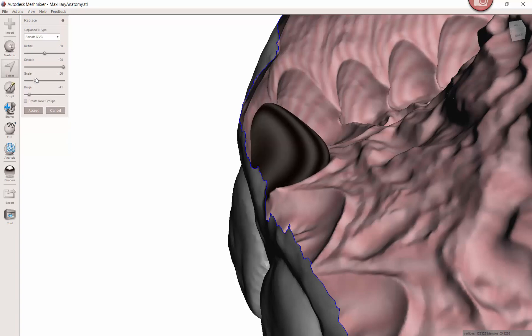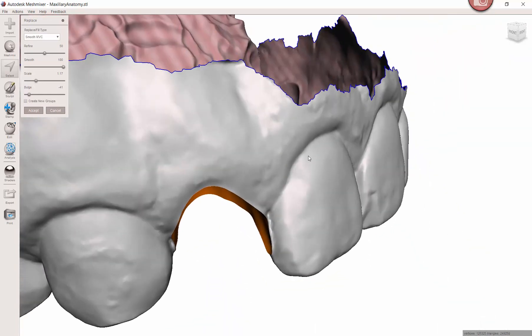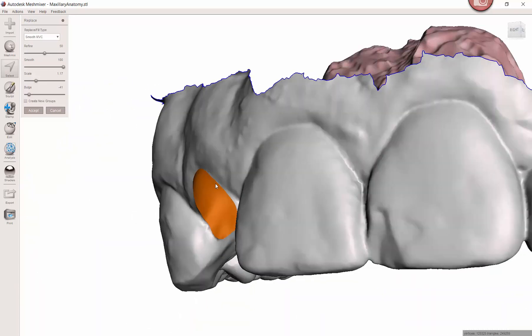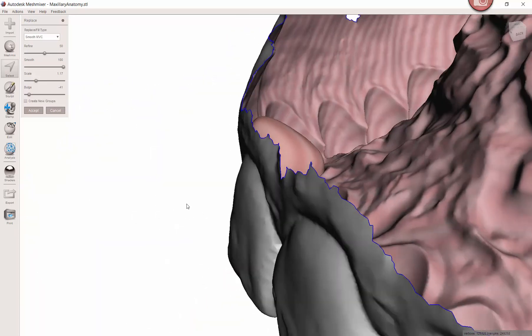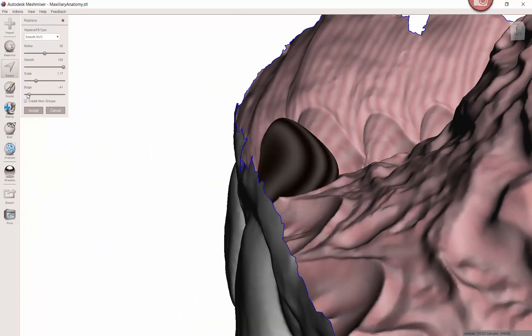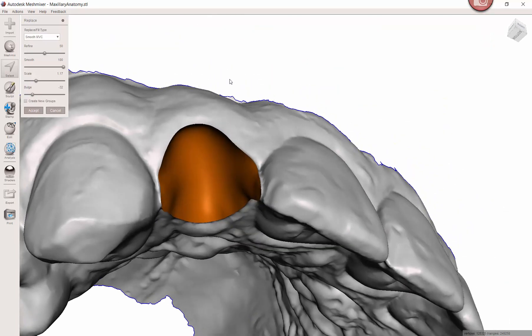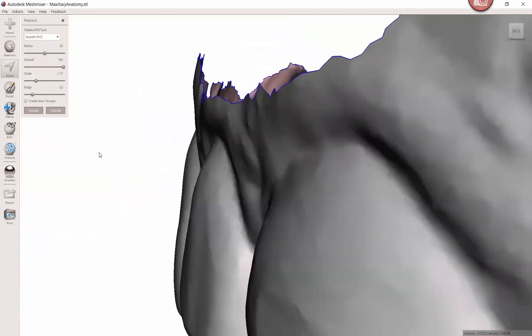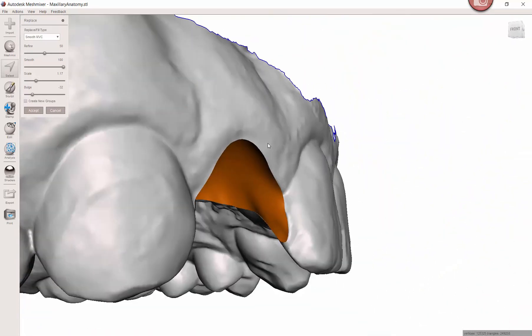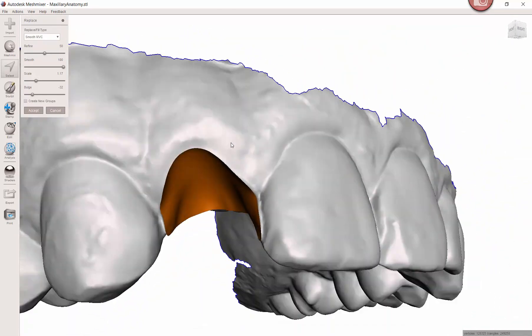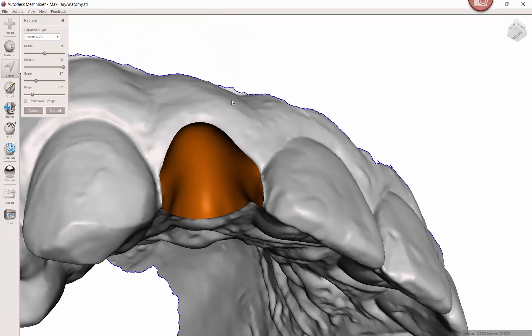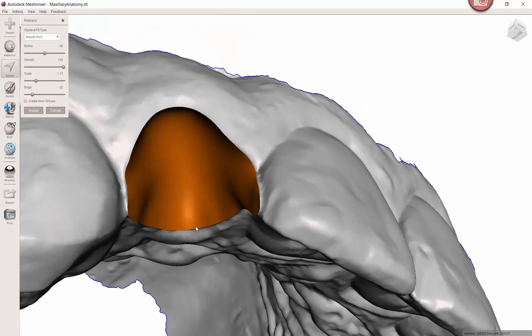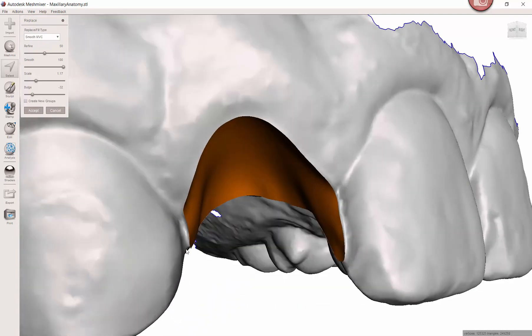If you're going to be creating some sort of flipper or Maryland bridge or whatever, an immediate temporary, you might want it to be a little more ovate so it extends down in there. So pick your poison, choose your adventure if you will. When I'm done I hit accept and watch what happens along the edges, you're going to see a little bit of a refinement that occurs. It's almost rough, it's printable, not really something to worry about.